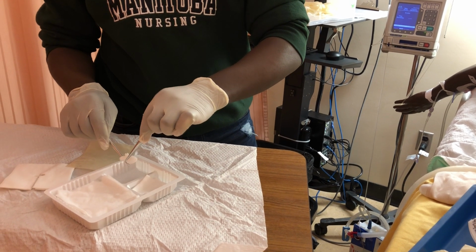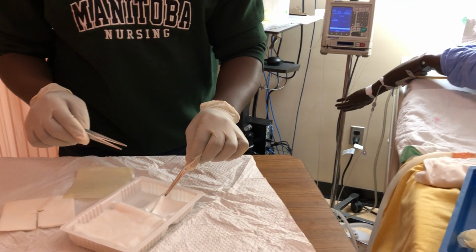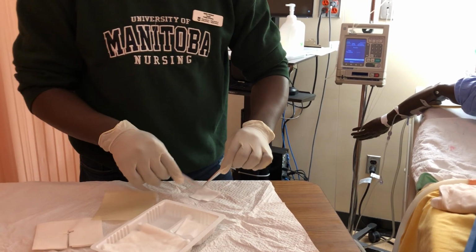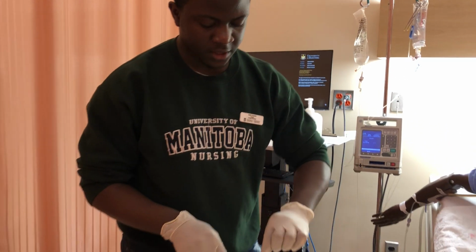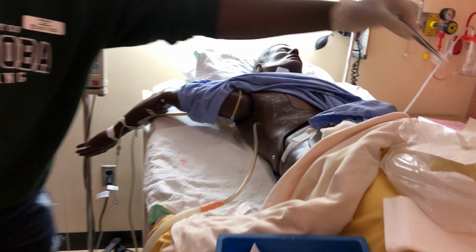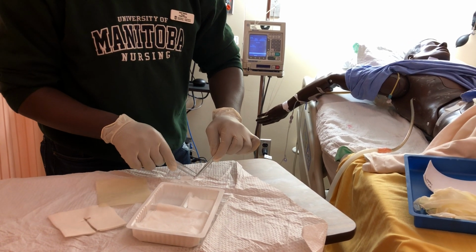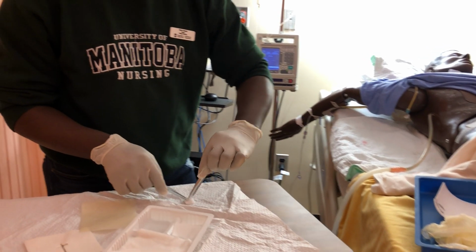And just clean that. Just one swipe on the other side, and that goes to the garbage. And then I can make another 2x2, and then I'll clean this time around. I'll go a little more outside, out of the wound, to make sure I clean the surroundings as well. I'm going to open up one. I'll just clean this a little bit outside, and then garbage that as well. And then I'll do that for the other side too.